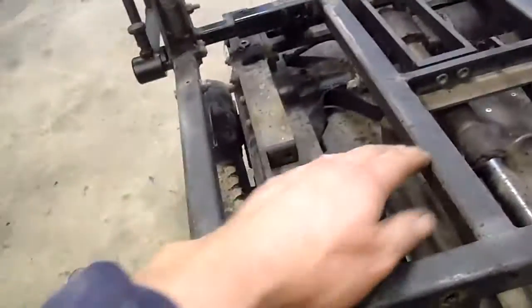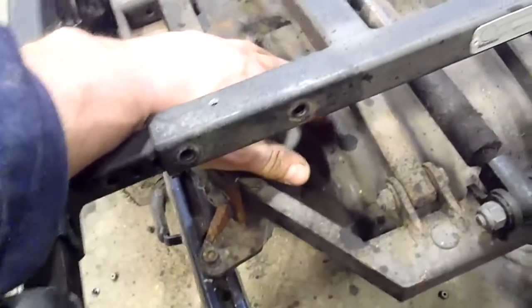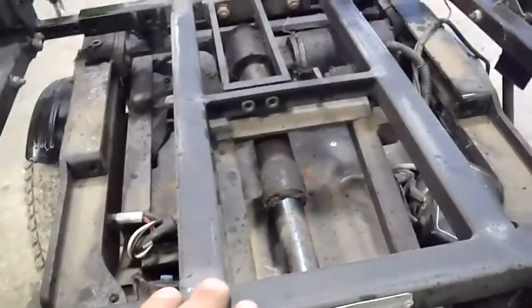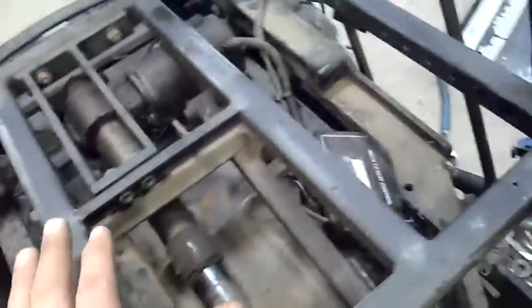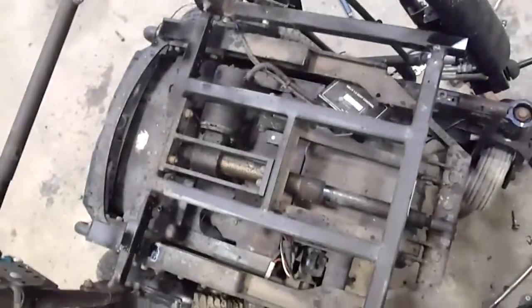So as I was saying, I only have so much clearance in between this frame and the top of the batteries and the control. There is control for the motors and relays and stuff in this box here. So this can only go down so far, and then this is kind of neat. Here you get a really good look at the actuator. This electric actuator, there's a motor there, and then this is just like the equivalent of a hydraulic cylinder, and this is just like a dump box frame on a dump truck. So it's pretty neat. I like the design.